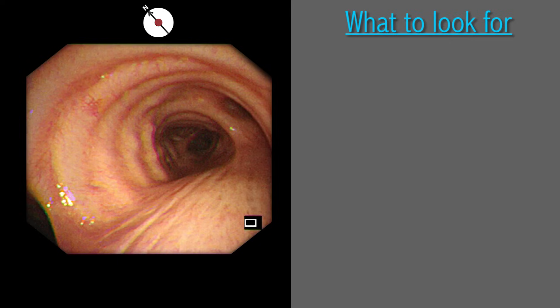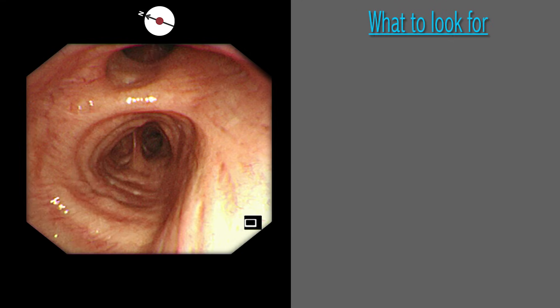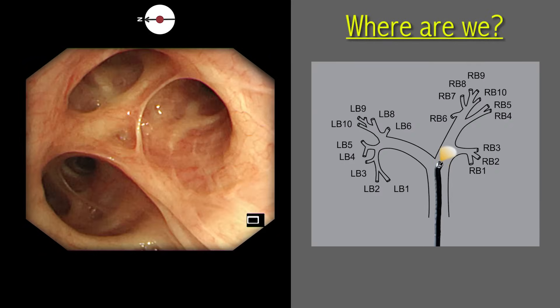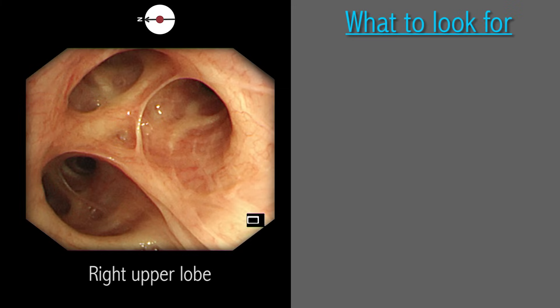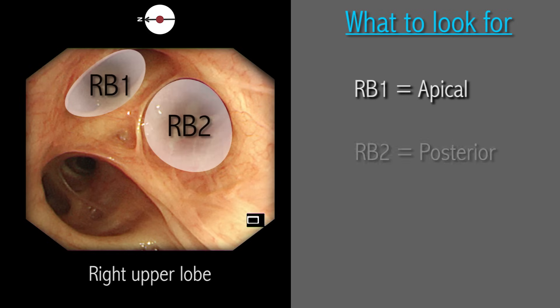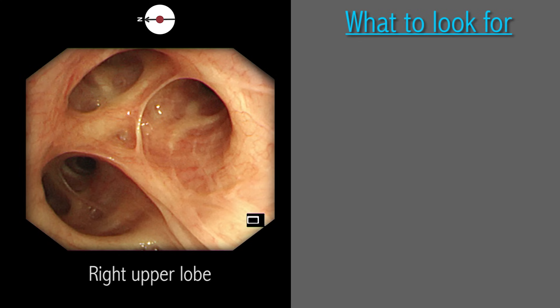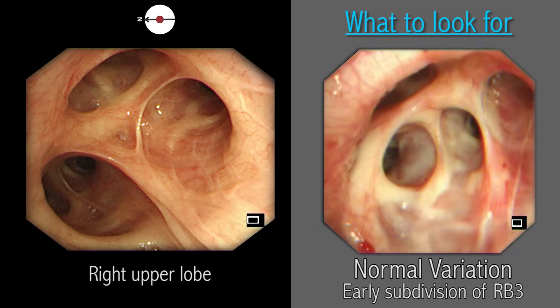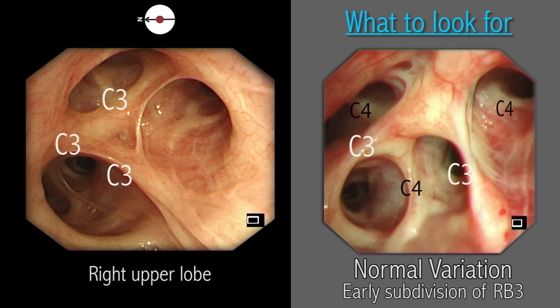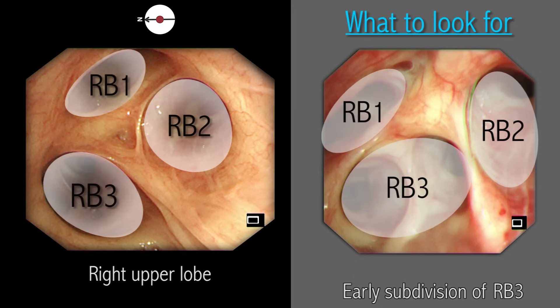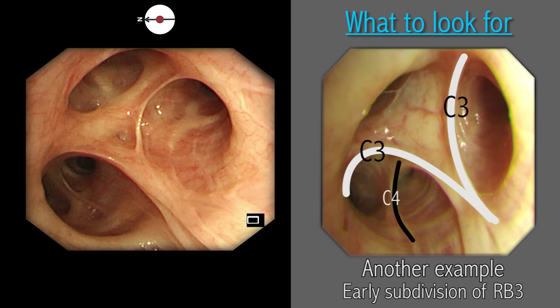As the scope turns to negotiate the segmental orifices, it is turned 90 degrees to the right and the take-off of the right upper lobe can be seen at 3 o'clock. On advancing the scope further down, one is greeted by the Mercedes-Benz sign, which helps identification of the right upper lobe bronchus. The latter divides into three segmental bronchi: apical (RB1), posterior (RB2), and anterior (RB3). A common variant is four divisions instead of three — the anterior segment RB3 divides early into two subsegmental bronchi, giving the impression of four divisions. By seeing the carinae first, it becomes clear which is C3 and which is C4.